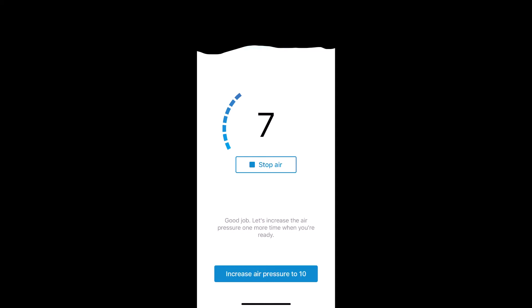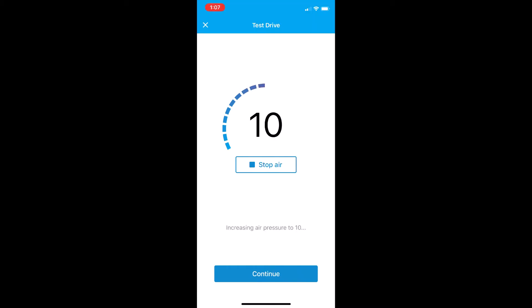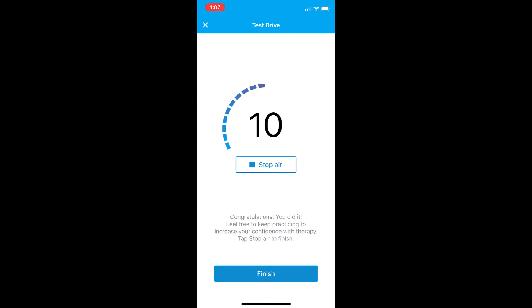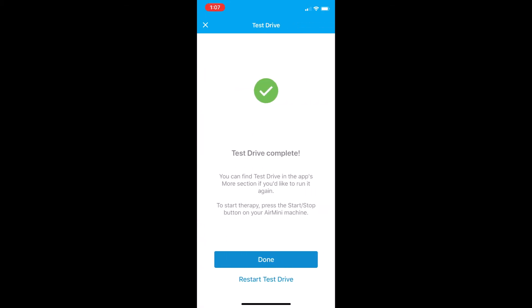Good job! Let's increase the air pressure one more time — increasing air pressure to 10. This is as high as we'll go during our test drive. You're almost done. Congratulations, you did it! Test drive complete. You can find test drive again in the app.